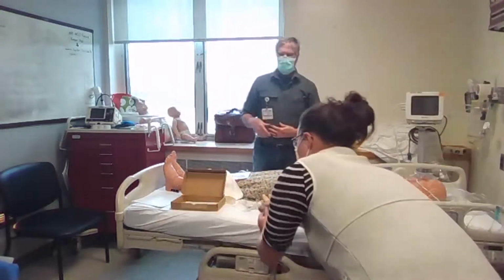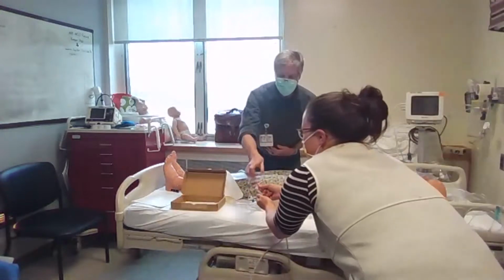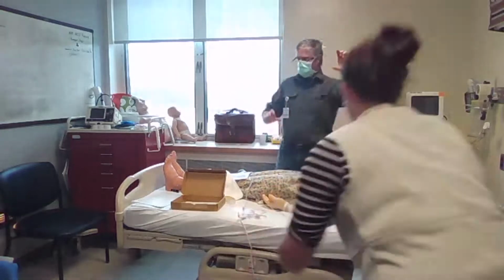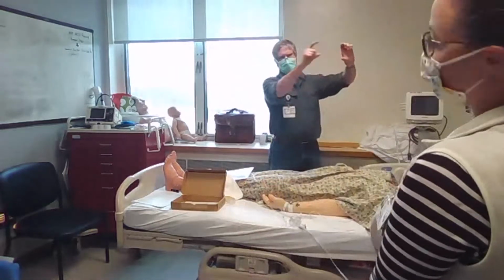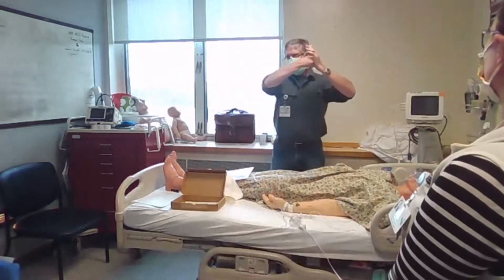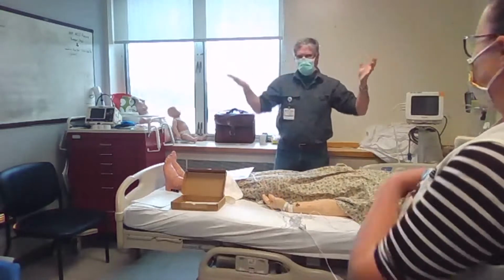And so this is the, it's like a phone jack. Yep. You plug the phone jack in and there's a little box. It'll say art on it or arterial. And it just goes in and it'll be that same red color. You plug it in and then we'll go through the stuff after.